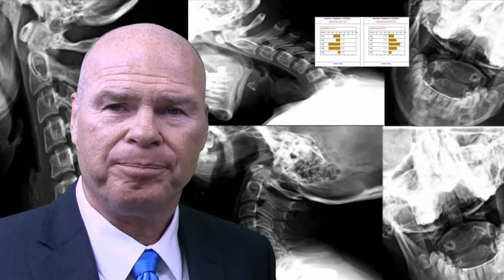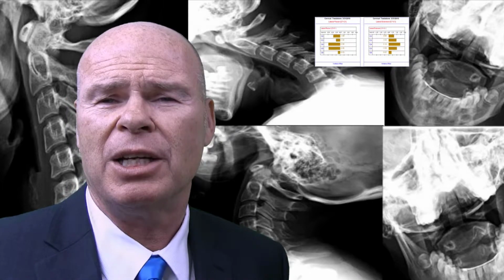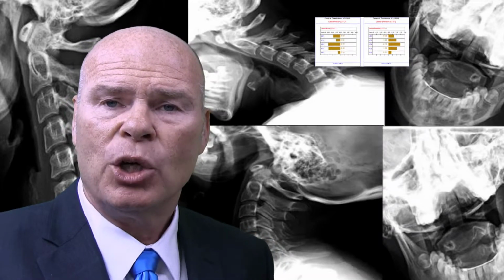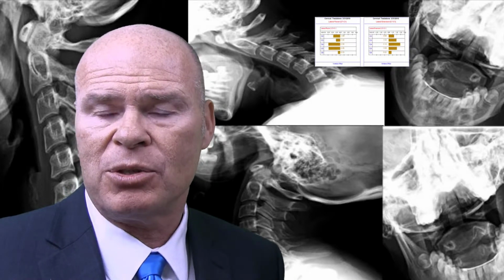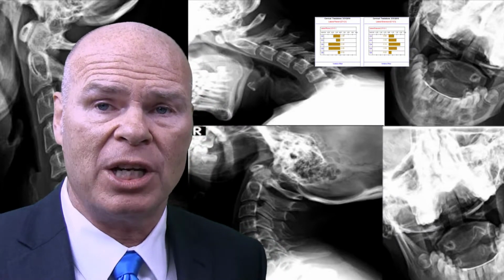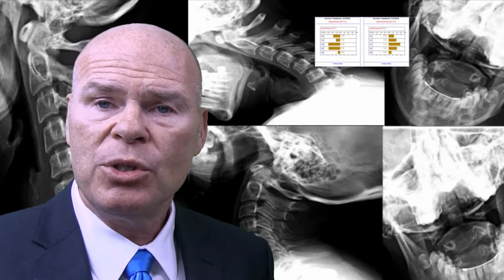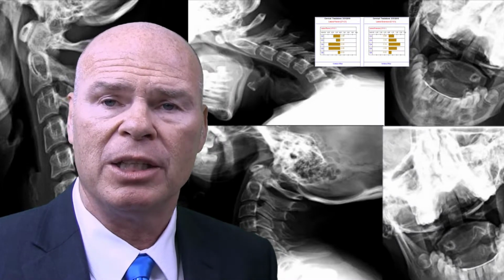Number 3, you're supposed to make an assessment of any spinal instability. So what's a spinal instability? That's the medical definition of a chiropractic subluxation. It means malmotion or malposition that causes a motor, sensory, or a pain problem associated with it. So it's the same thing. It's a clinical entity, not just an imaging entity. You have to have both clinical findings and the findings that reflect back to the image. So as soon as you remove the motor, sensory, or pain problem, you've removed the spinal instability.